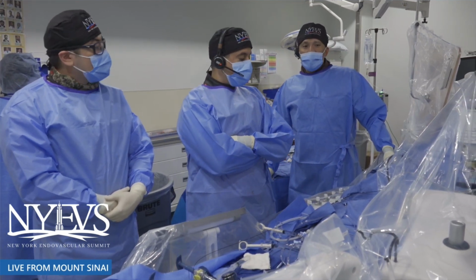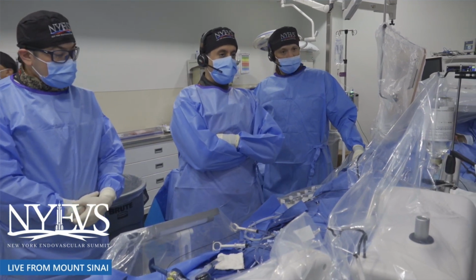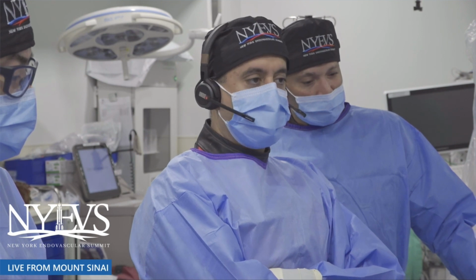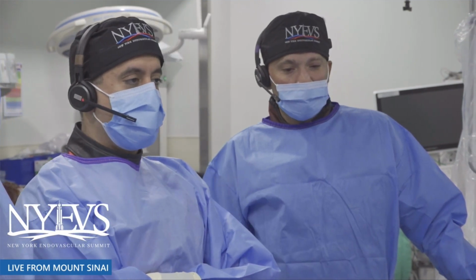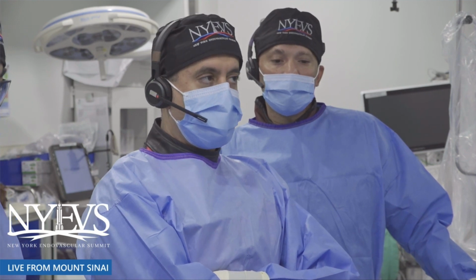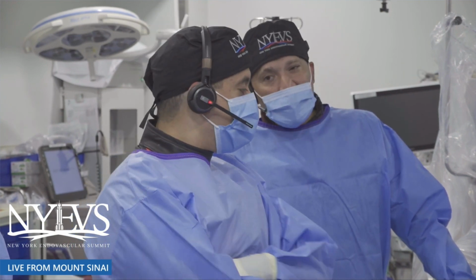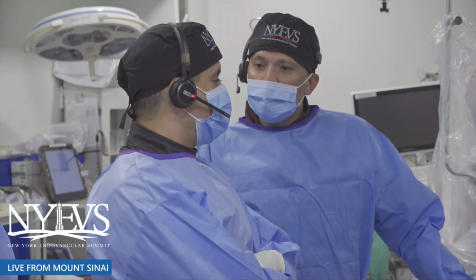I think the other thing that I look at when I'm looking at calcium and deciding on lithoplasty is how extensive is the calcium, and how much of the lumen is compromised by that calcium as well. If this is 95% occluded, it's hard to tell from the angiogram, but this is really significantly impairing the lumen itself. Even though it's eccentric, I actually think IVL helps here and allows you to better expand the stent. That's why I think having axial imaging, whether it's IVUS or CTA, is critical in decision-making here.